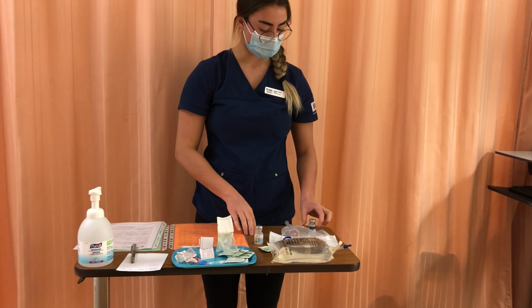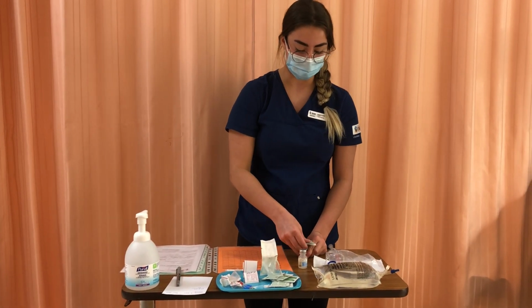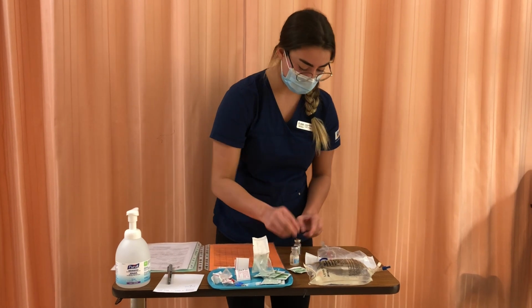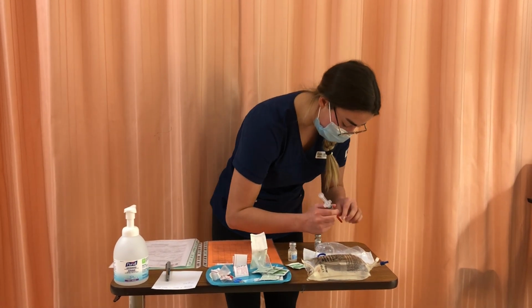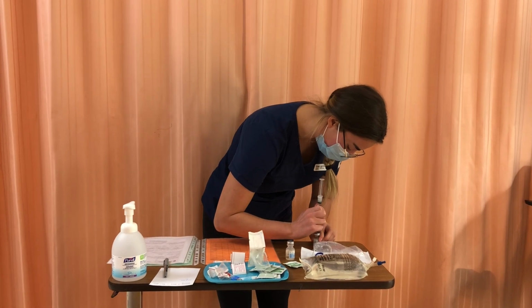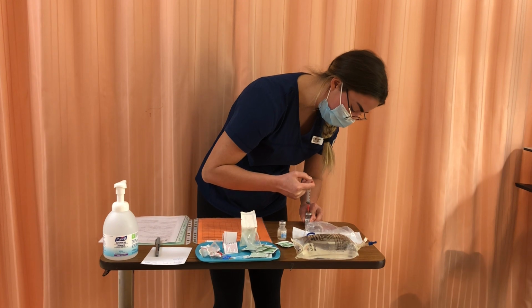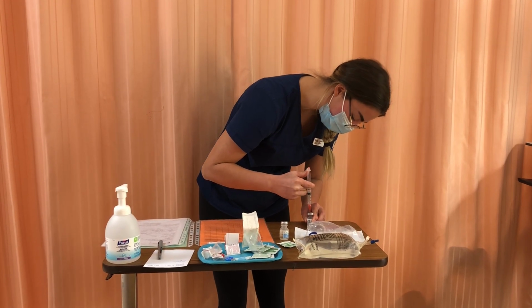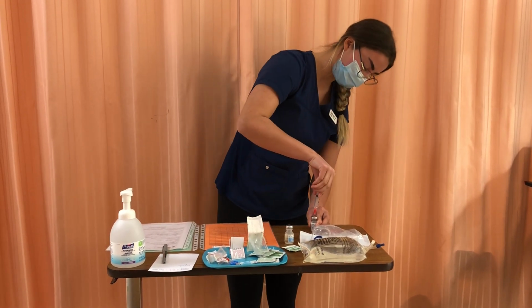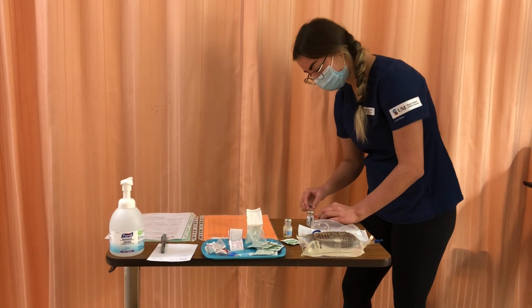Now that I've done that, I'm ready to inject it into my medication vial. So I'll swab for 30 seconds. Let dry for 15, and then I can inject this in there. And then I'll let any air displace from my vial. There we go. And then I can recap.